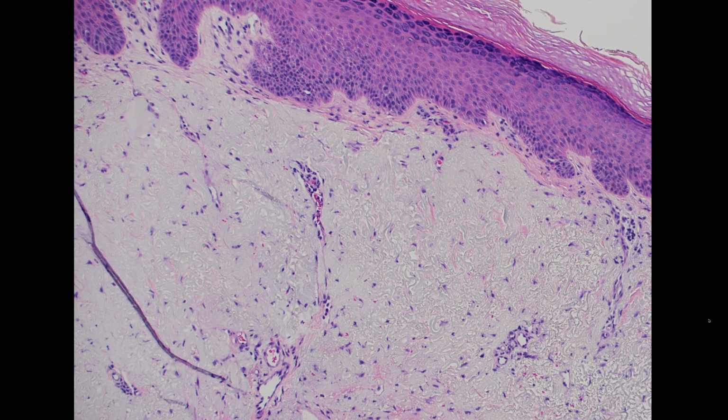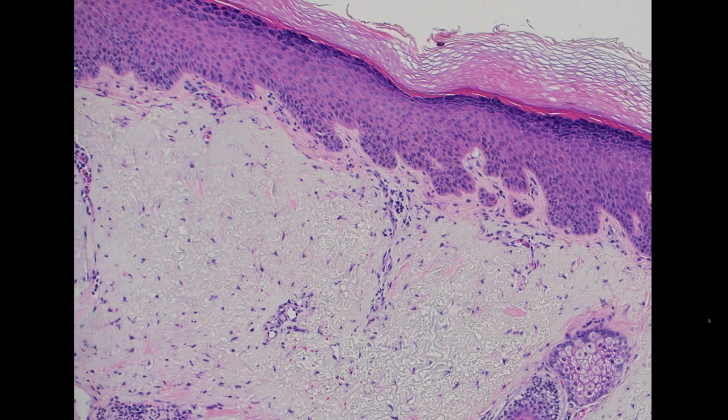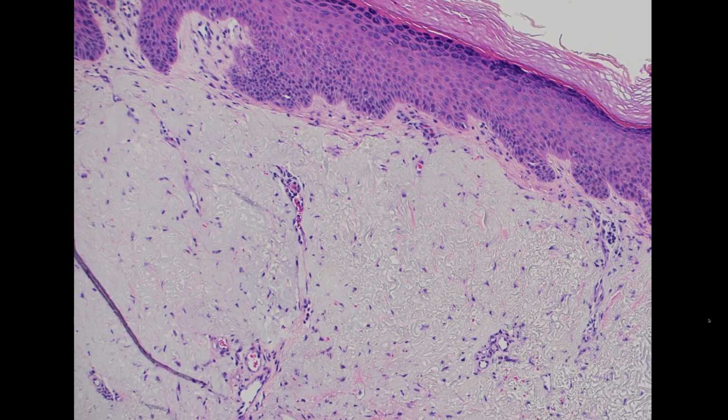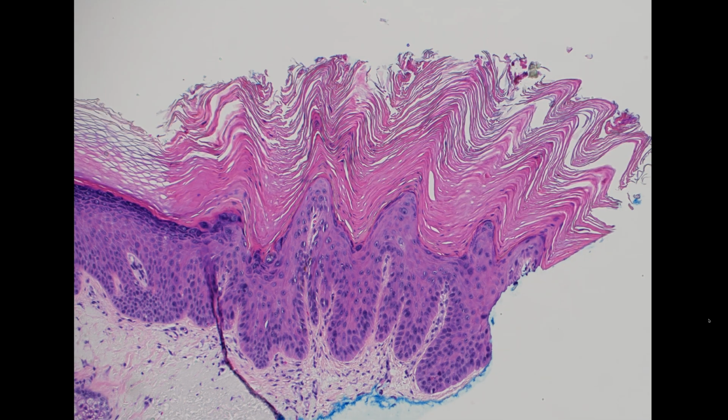This is day in and day out, hours and hours of sun damage over many, many years, where the dermis is filled with these tangled mats of elastic fibers that push the normal collagen down, and they replace the normally pink collagenous looking dermis with gray-blue solar elastosis. So this is a sign of heavy chronic sun damage over many years. Usually we see that much sun damage in elderly patients in sun-exposed sites. This is definitely very severe solar elastosis, and this is the kind of environment where we often see actinic keratoses, squamous cell carcinomas, and other skin cancers.